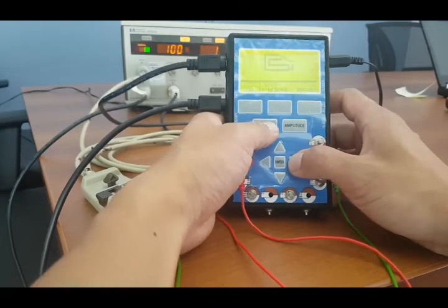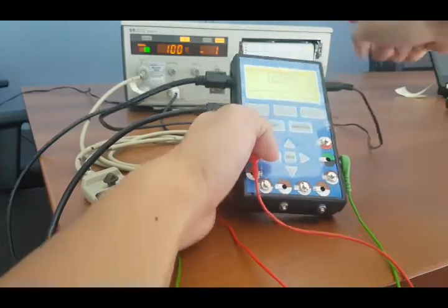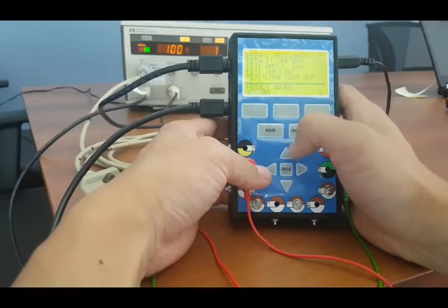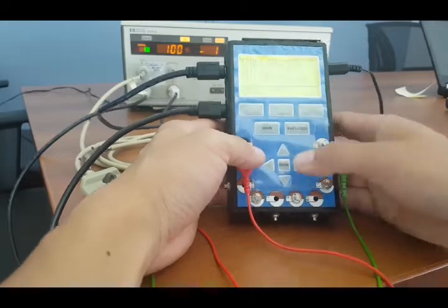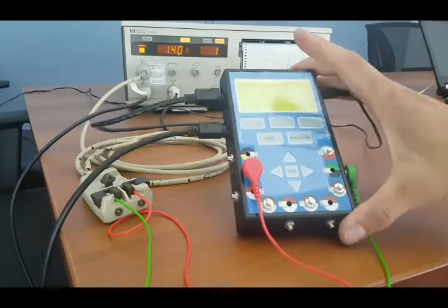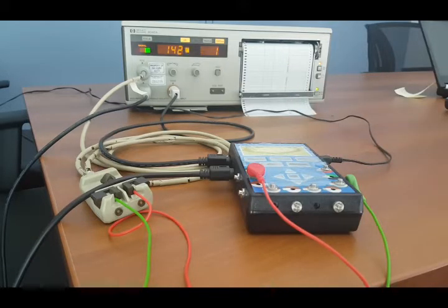Now to start my actual Toco waveform, I'm going to start the graph on the right hand side. Go to my waveform number 1 and click on enter for the normal waveform. And the monitor or the simulator should have the Toco waveform generate in about 30 seconds to 1 minute or so. So we'll wait here for the signal to be generated. And here we go.